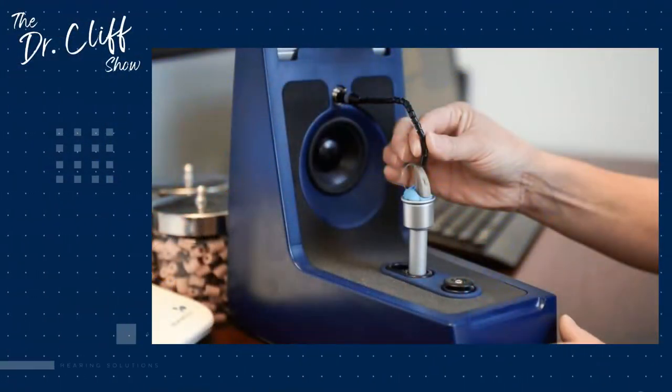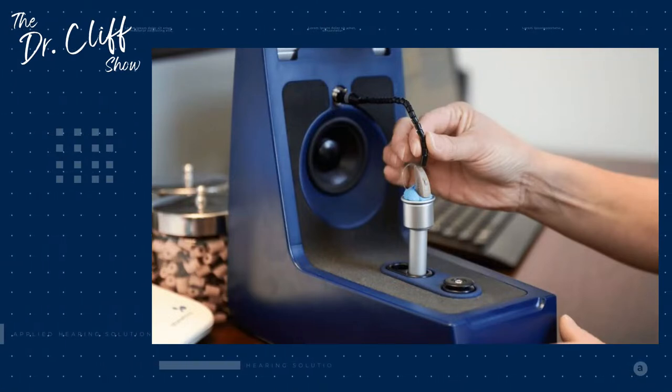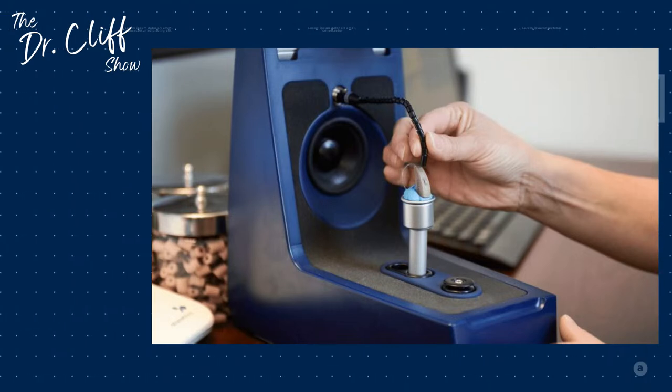Absolutely. Now, before we get into the data sheets and show you guys what we're actually looking at, let's show you an image of the test box. We use a very particular test box in our clinic. That is exactly what it looks like right there. And you can see that there's a speaker right there in the center of the screen that is actually playing a calibrated sound to the hearing aid that is mounted on that pedestal with putty.